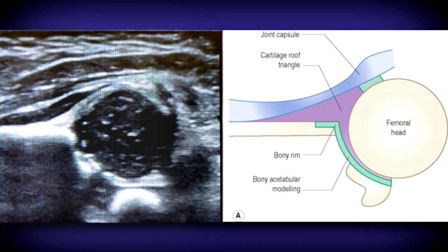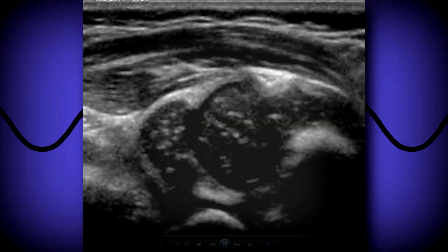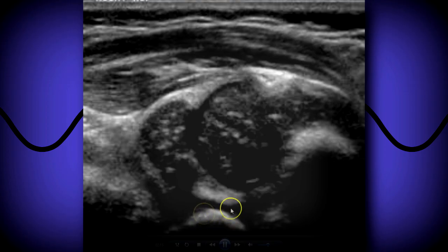Here's a coronal or longitudinal view of the hip. This echogenic line is the ilium, which dips down to become the bony acetabulum. Here is the femoral head — you can see all the little interfaces showing the spongy bone. This is the labrum, and then this is the ischium. Here is a transverse view, and you can see the femoral head in the acetabulum. Just posterior to it you can see the ischium, and here you can see the beginning of the femoral shaft. This patient is still young, so it's still cartilaginous.